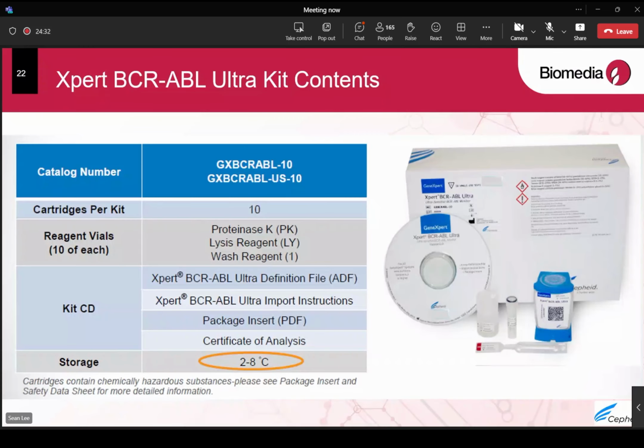So, kit handling. You will receive 1 box of Xpert BCR-ABL Ultra test. 1 box contains 10 tests. It contains 1 CD. It has all these reagents: proteinase K, lysis buffer, the lysis reagent, and wash reagents. All these are required to run a test.